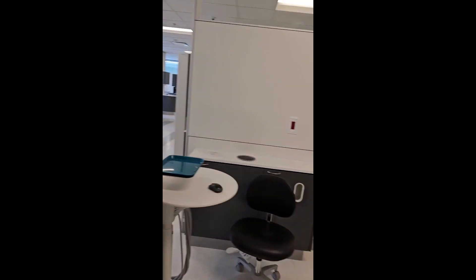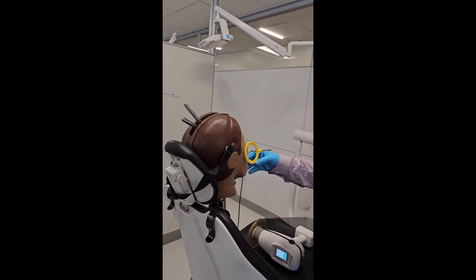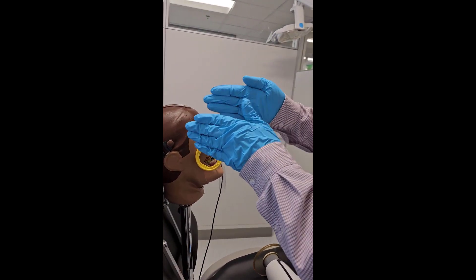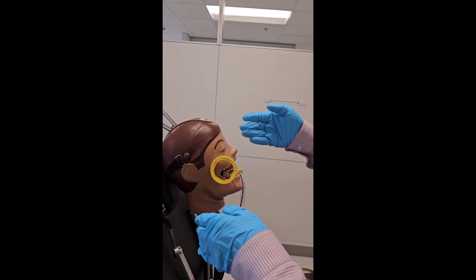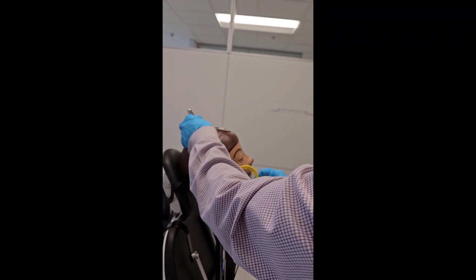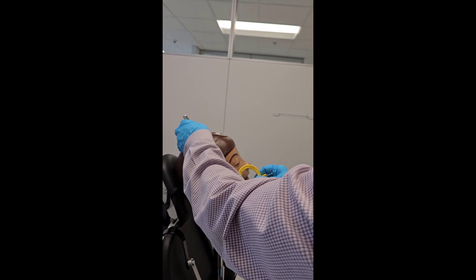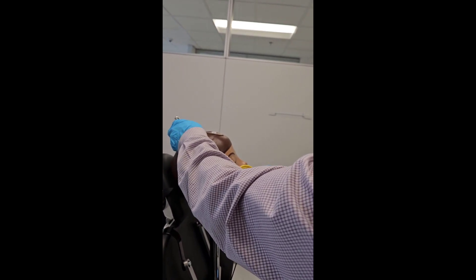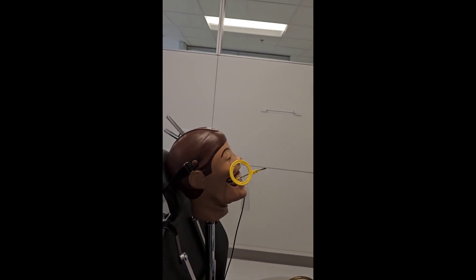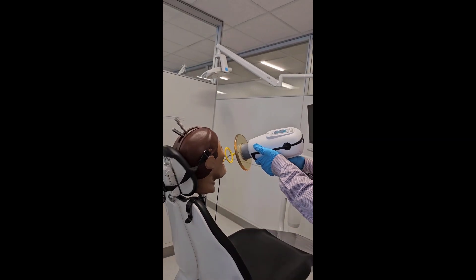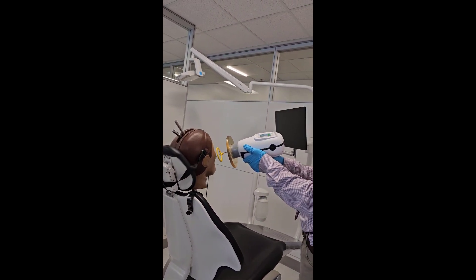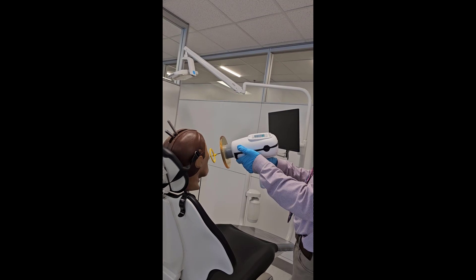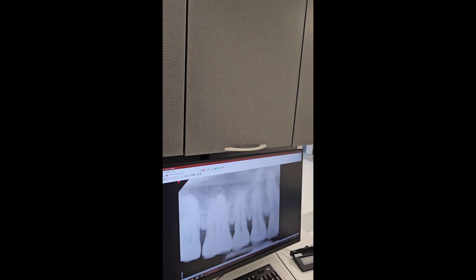Maybe just to show you the same thing with the premolar — I'm going to slide this forward, do a little bit of mesial angulation rotation. Make sure your patient's biting down all the way. Again, just come in parallel. It doesn't have to be a super steep angulation to capture the apices.